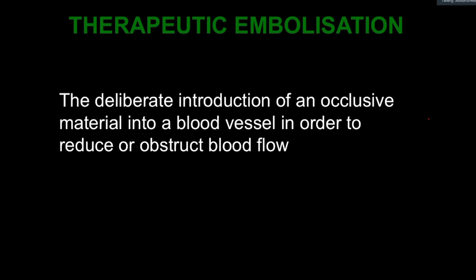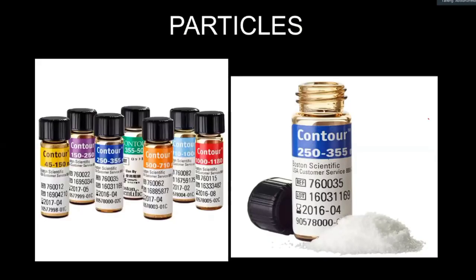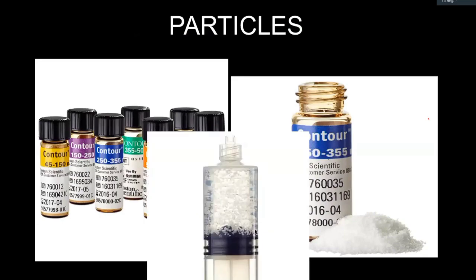Embolization is the deliberate introduction of an occlusive material into a blood vessel, in this case in order to reduce or obstruct the blood flow. Basically, we put something into a bleeding blood vessel to stop it from bleeding. There are many embolic agents that we use. We have something called particles, and they come in a variety of sizes. We mix them with contrast because they're not radiopaque.